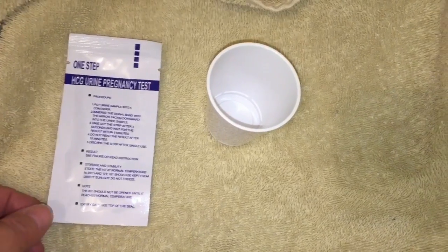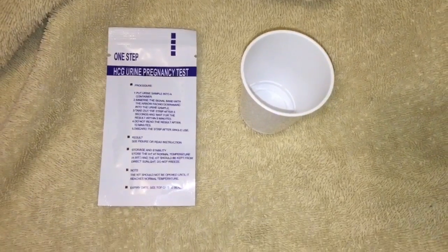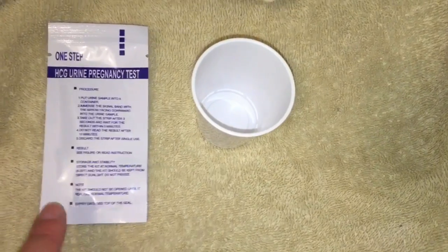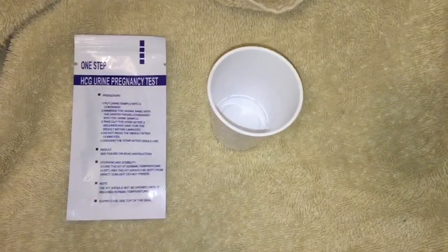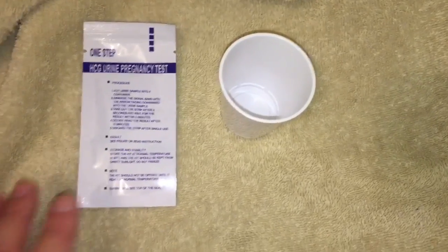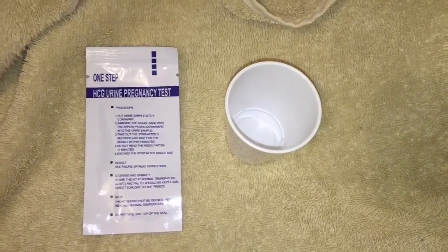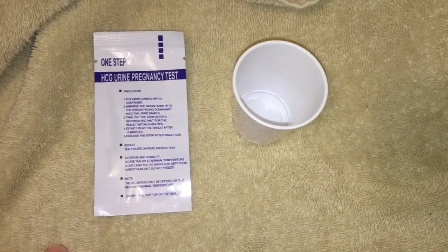I got 25 tests for about $7, so I think that they're a lot cheaper. Just to let you know, with my daughter, the first time I took the test it instantly came up positive and I was only five weeks and one day. I know that specifically because two days later I had an ultrasound done with my doctor. So this specific test — the strips — I think it's 25 HCG. Five weeks and it came up positive.